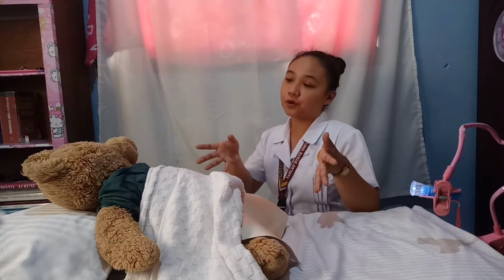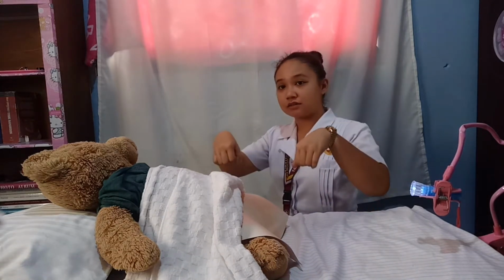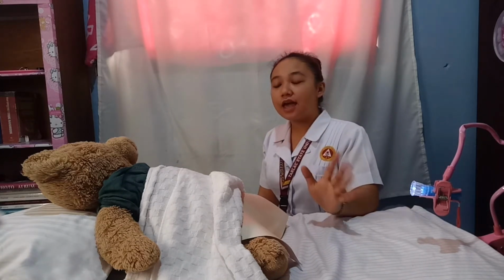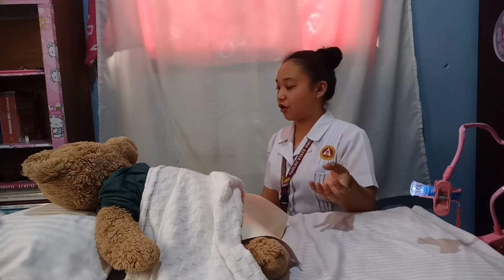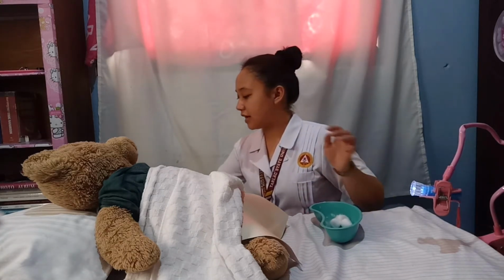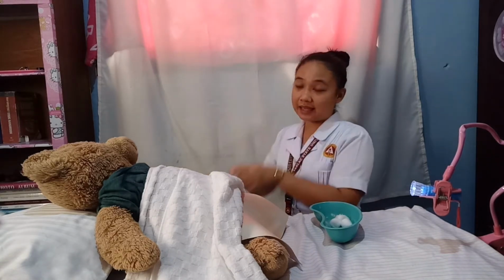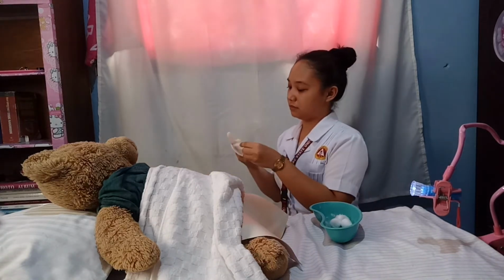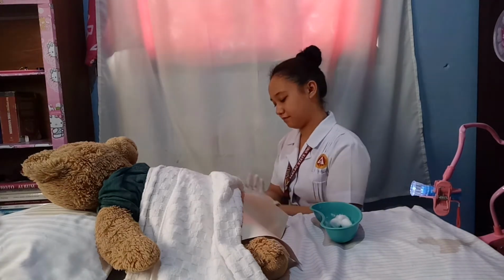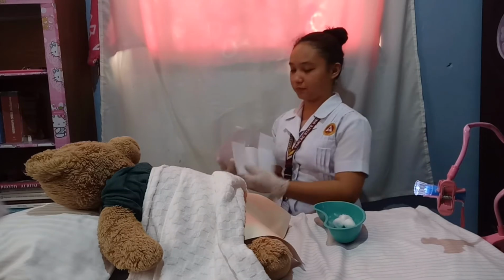If your patient or client is male, you need to assist him in a supine position with the legs slightly abducted. Then you need to clean the genital or perineal area with warm water and soap. But before that, you need to put on clean gloves. And then put this one.